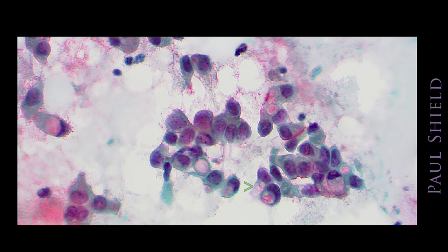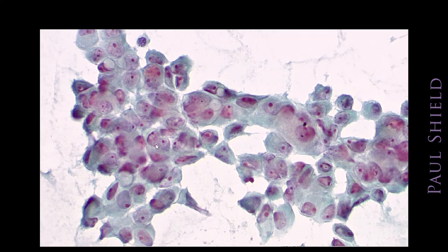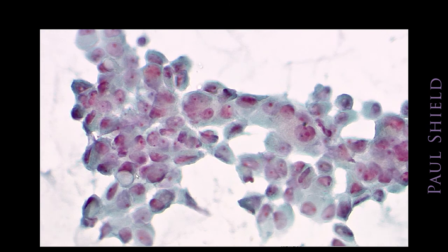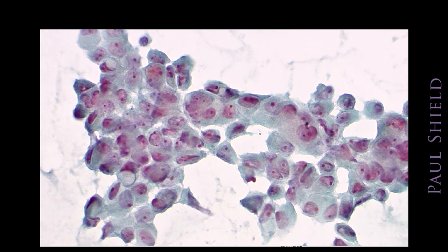These are little, fairly uniform, as you expect for well differentiated tumour cells, and they have these little targetoid vacuoles in them. This can be a useful feature to identify that this is an adenocarcinoma and not something else that would produce a plasmacytoid cell. This group here is like a sort of crowded sheet of cells. There's little nucleoli in all of these, but again, notice little hard-edged vacuoles in various places in here. And as I was saying, this can be helpful in separating glandular tumours from other lookalikes, maybe like melanoma.